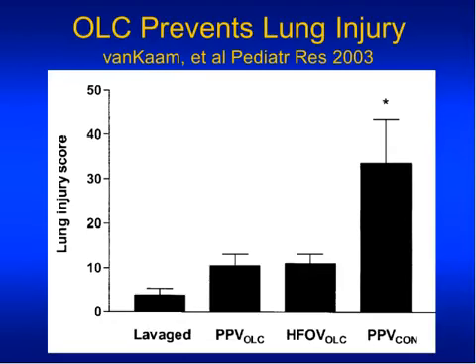Then you have to set your pressure limit so that the machine can adjust the working pressure both up and down. And we need to keep it roughly in that relationship, because it's among the benefits of volume-targeted ventilation. If everything is good, and tidal volume is being reached with a pressure limit of 20 or 25, whatever you had, all day, and all of a sudden it's alarming, and it's alarming persistently, something's changed.